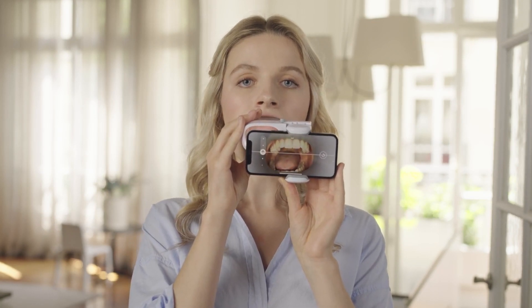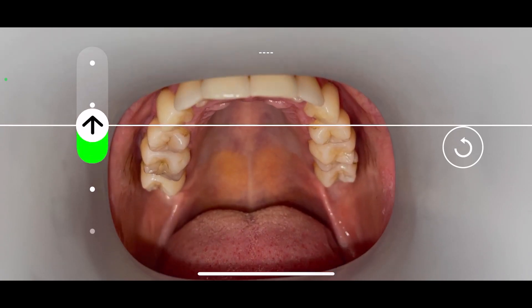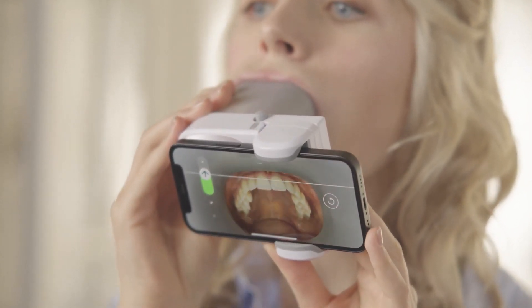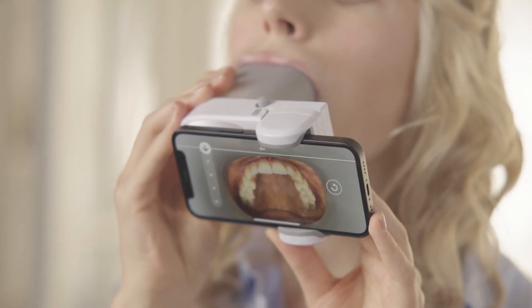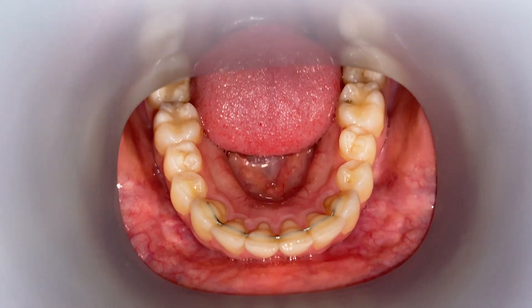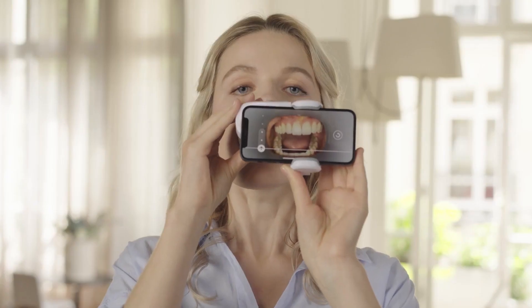Tilt the scan box up. Tilt all the way up until you can see the whole biting surface of your teeth. You can also tilt your head slightly in the opposite direction if that is easier. Now tilt the scan box down. Back to the front.